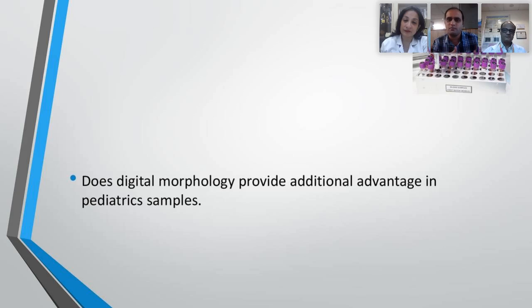If the slide is properly spread and you get a good slide, there is no problem in the digital thing. Moreover, any automation, be it flags in your hematology analyzer or this digital imaging, lymphoblasts, especially those L1 types, require trained and skilled hematologists. And anyway, with a digital platform, till now we are not going to just send the reports to the LIS directly before.